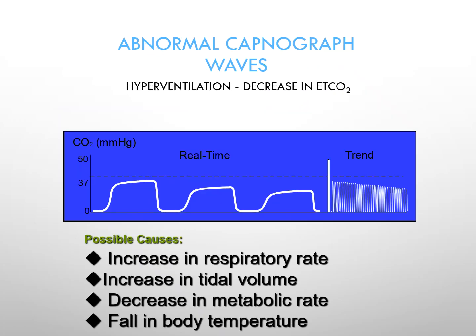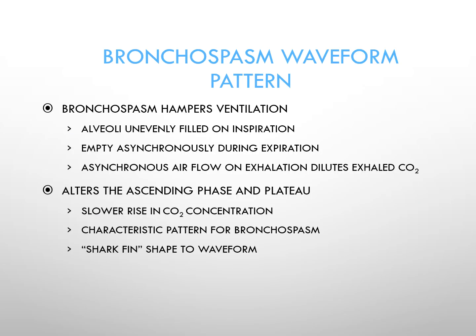In this example, you see a nicely shaped initial breath and subsequent breaths, but you see the plateau decreasing or declining, okay? And that's suggestive of either the metabolic state having gone down or the patient in some way hyperventilating, such as you may see with pain or anxiety, something along those lines. So focusing a little more in depth on what happens with the bronchospasm waveform.